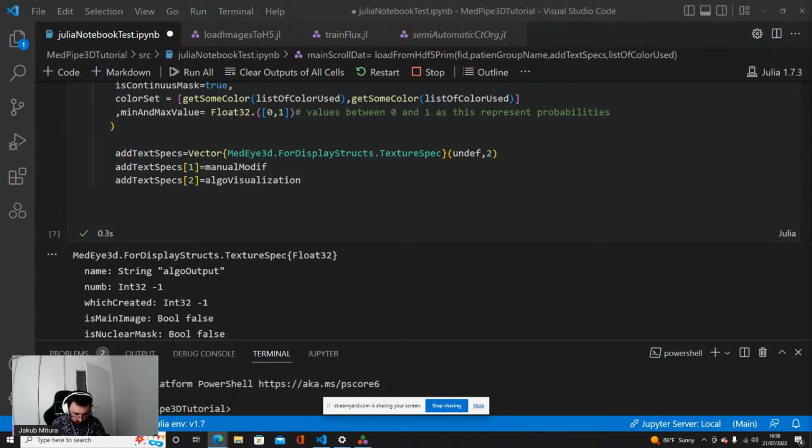Yes, so you loaded some paths. M1 Mac. Oh, okay. To be honest, I did not test this on Mac computers because I do not have any access to this. What you are showing me here is the OpenGL problem. Okay.